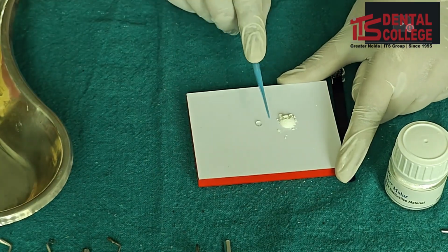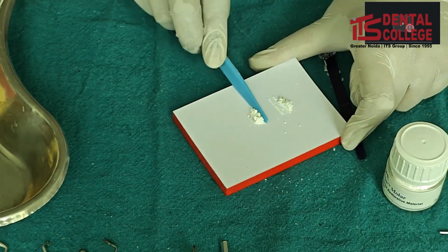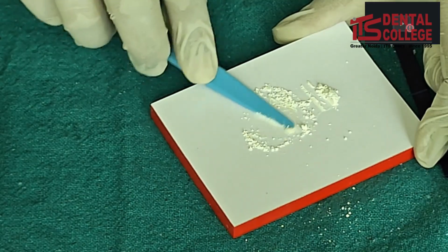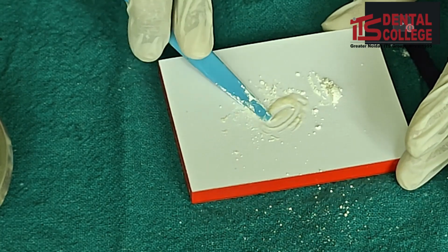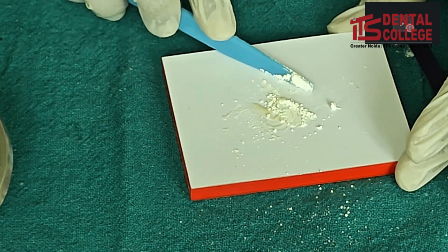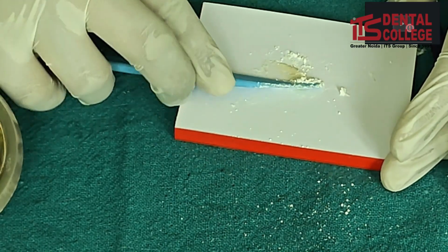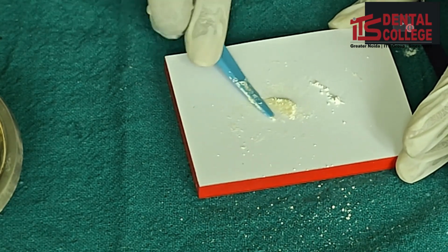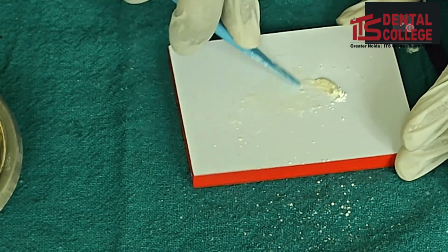For manipulation of GIC, the powder has to be divided into 2 equal increments. The first increment has to be incorporated rapidly into the liquid using round circular motions. Now the second increment has to be incorporated into the liquid using a swiping and folding technique. The swiping and folding technique helps in proper manipulation of GIC and in the formation of a gel-like structure.